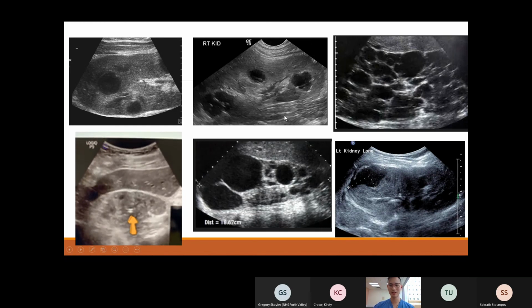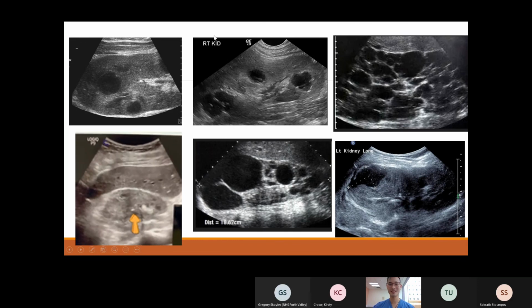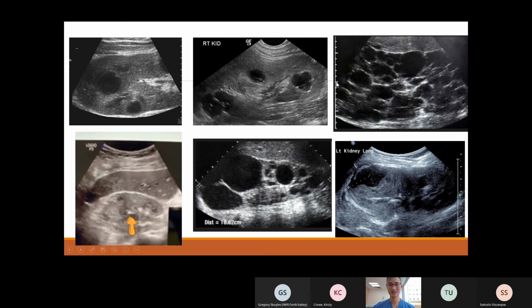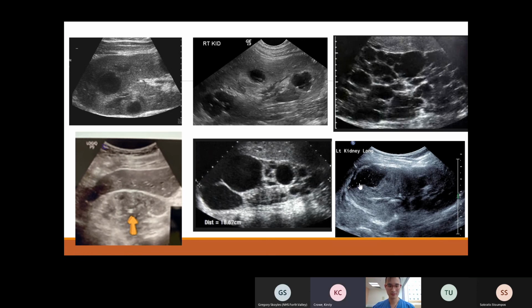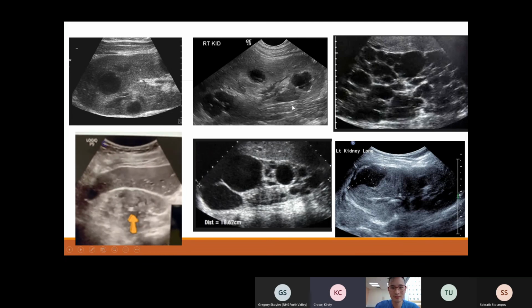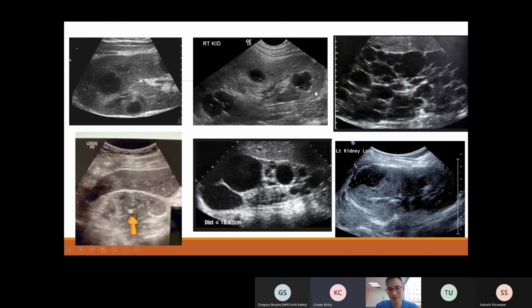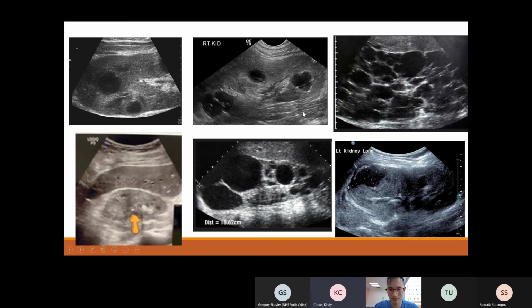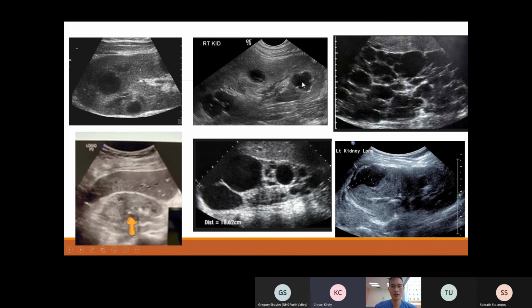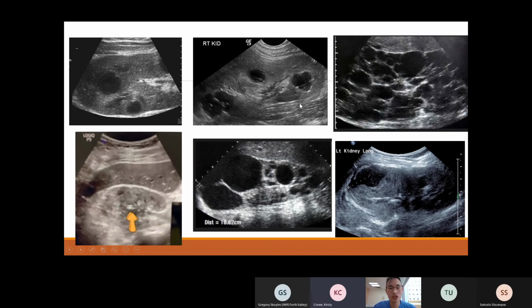Okay, so good. So that's that image. Now, can someone tell me, and this is one for the postgrads, what is wrong with this image and what the diagnosis is? Anyone? What do we have here? I'm not sure, but on the right-hand circle, it looks almost like there's a septated bit in it. I don't know if I'm reading into that. It's got hyperechoic kind of bordering to it, and I almost want to say it's got a hypoechoic kind of tail, like a shadow beneath it as well. So you're talking about enhancement or shadow? So there's enhancement. Kind of like bright shadowing.